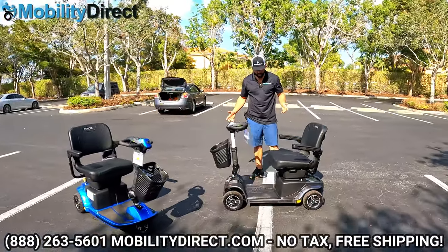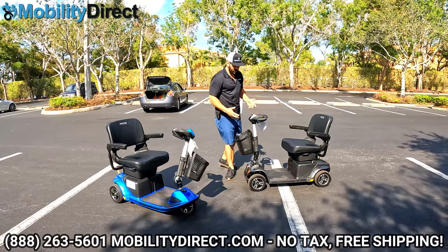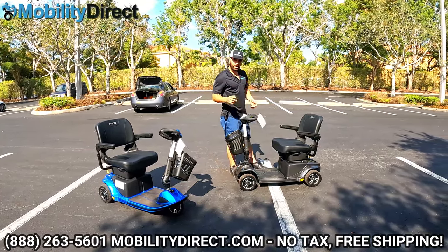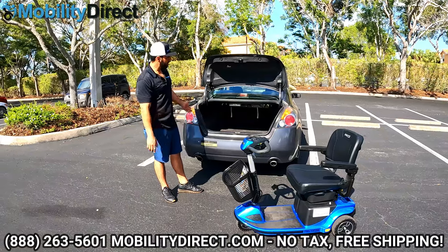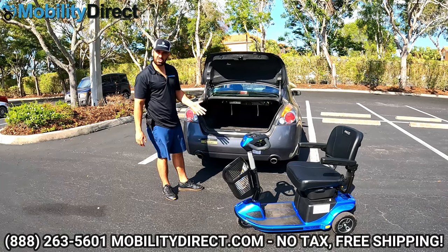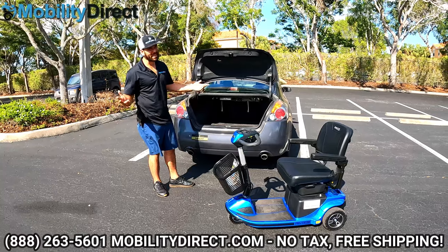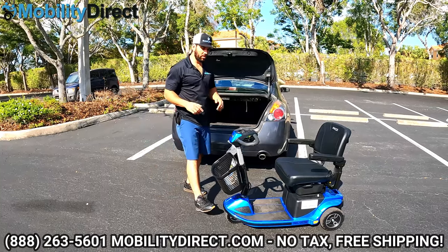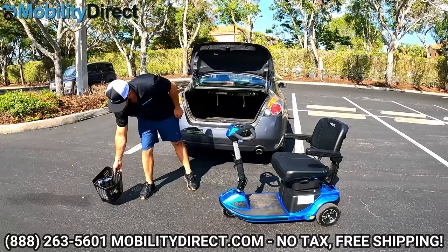That wraps up the demonstration of all the comfort features and what makes this scooter unique. Now it's time to take it apart and show you how easily it fits into the trunk of the car. We have a Nissan Altima here with a medium-sized trunk. This is a bigger scooter, so if you have a really small car like a Volkswagen Beetle, it might not fit — it really depends on your trunk space.